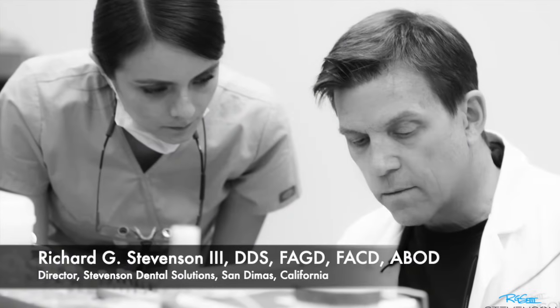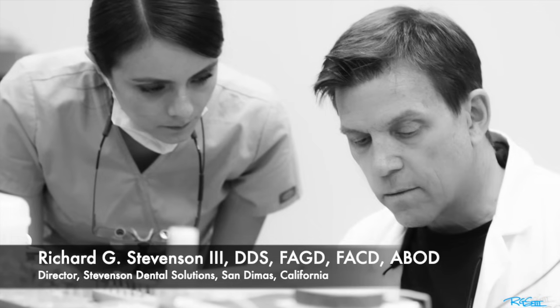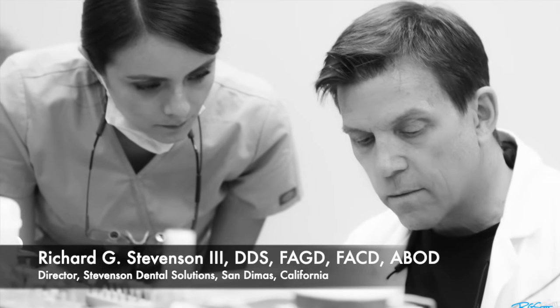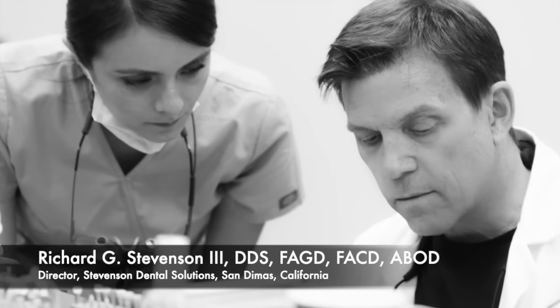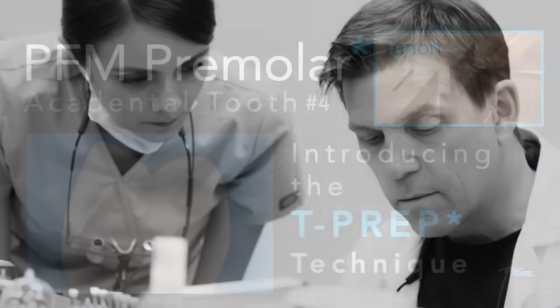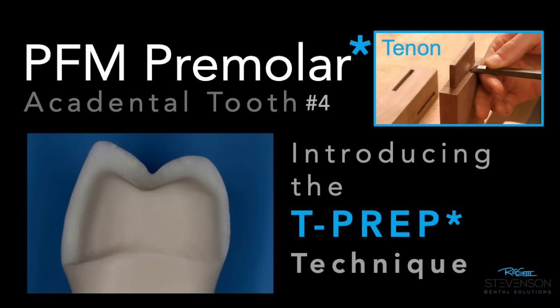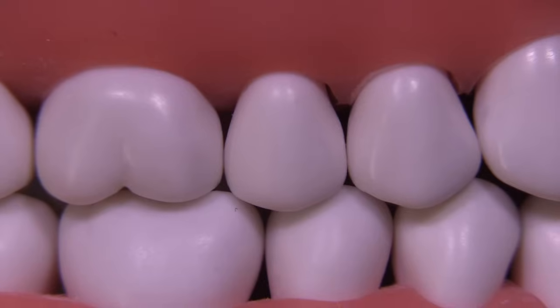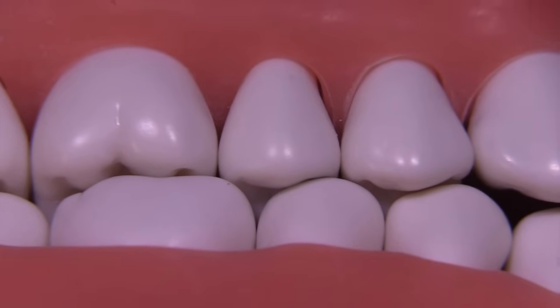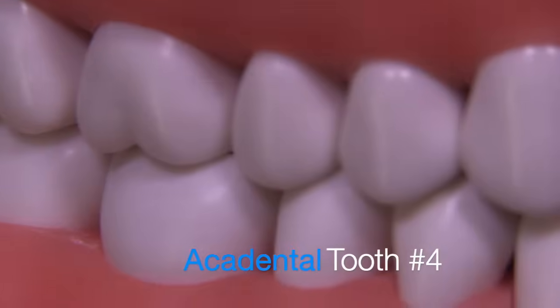Hi everybody, I'm Dr. Richard Stevenson and I'm the director of Stevenson Dental Solutions, a teaching center in San Dimas, California that focuses on excellence and hands-on courses to improve your skills and knowledge in general dentistry. Today we're going to be discussing the PFM preparation for a premolar on an Acadental tooth number four, introducing a technique I call the T-prep technique. This is a method of reducing outer portions of the preparation so you can make measurements on how much you've taken away. The T stands for tenon — a technique used in carpentry — so let's see if we can apply that to a dental preparation.